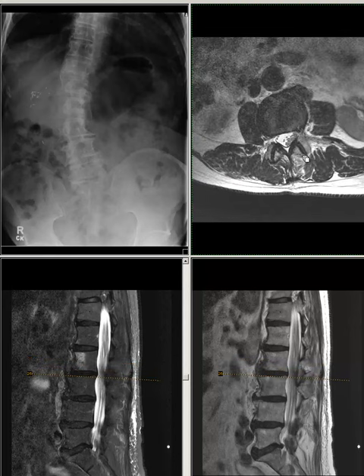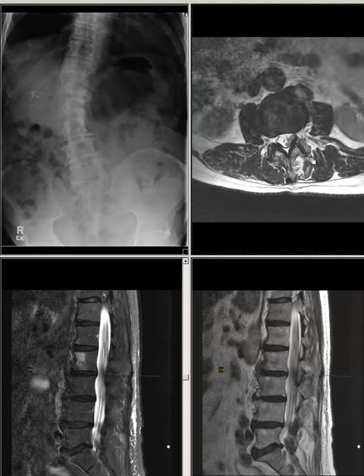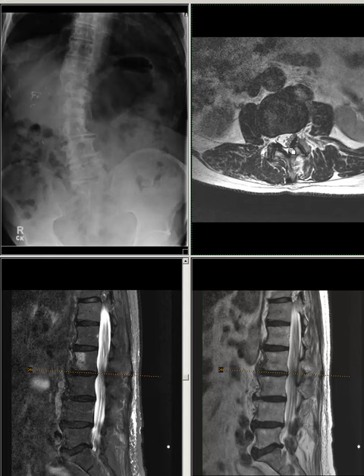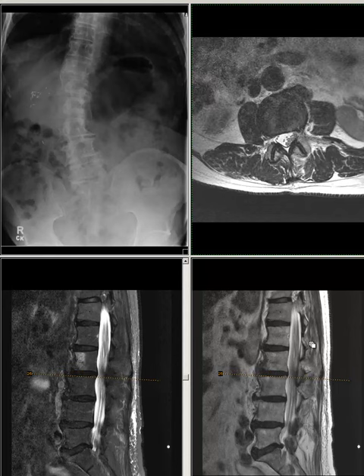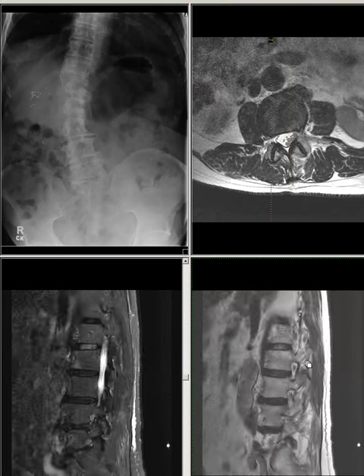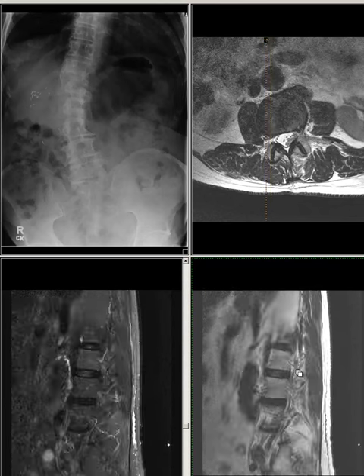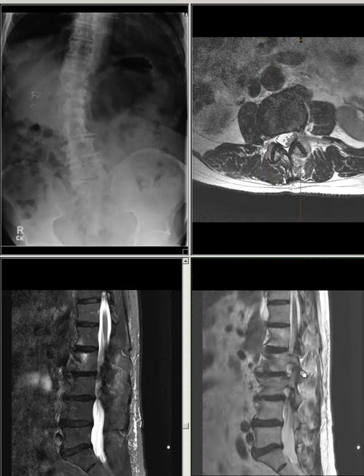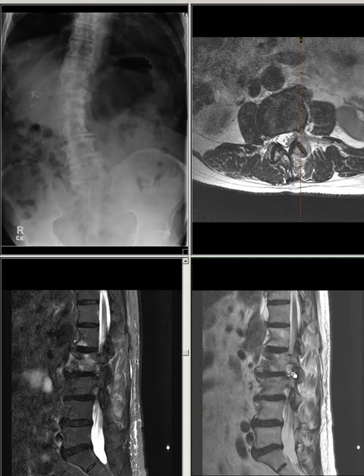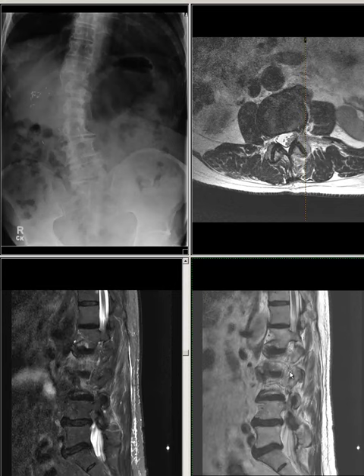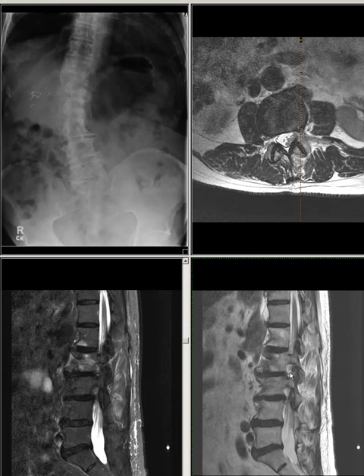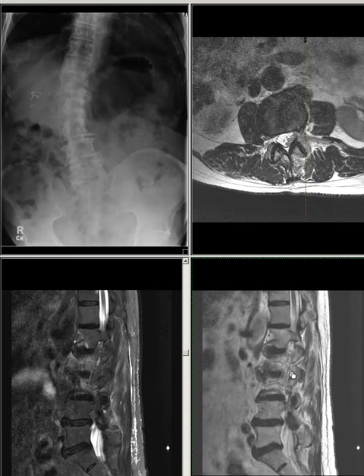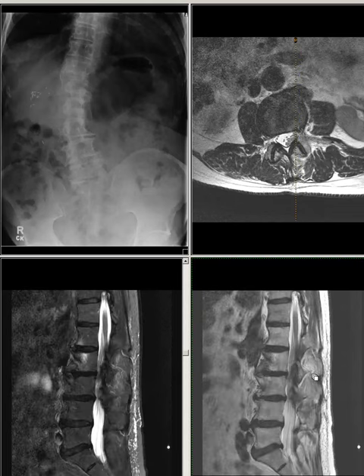L2-L3: There is disc desiccation and mild facet joint hypertrophy bilaterally noted. No evidence of spinal canal stenosis. The right side neuroforamen is patent. There is mild left side neuroforaminal stenosis without complete effacement of neuroforaminal fat or direct nerve compression.